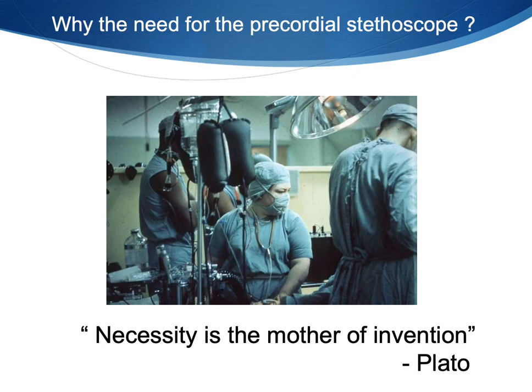In anesthesia practice, up until about the late 1970s and the early 1980s, the precordial stethoscope was the only useful continuous patient monitor around.